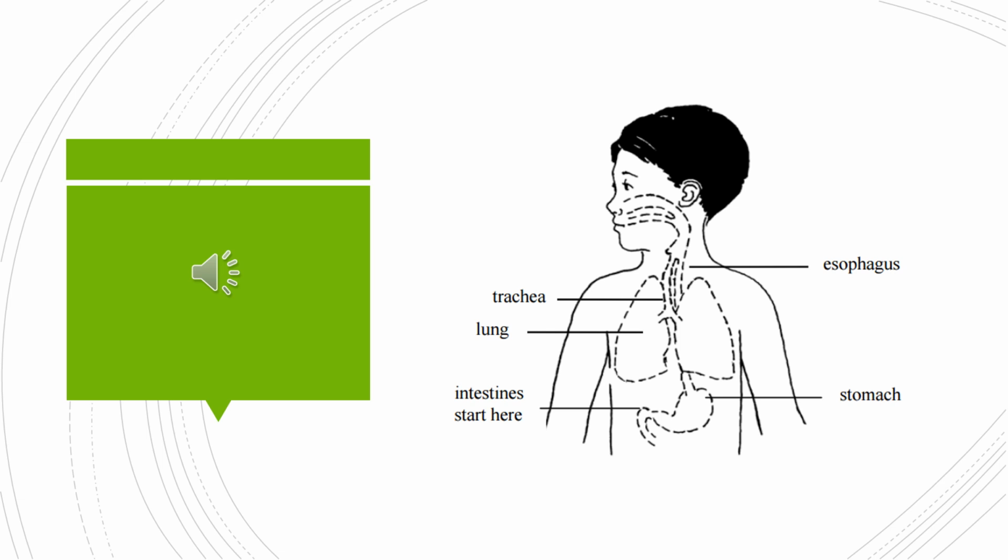The GJ tube is used widely in individuals with severely impaired gastric motility, high risk of aspiration, or an inability to feed into the stomach. It allows the stomach to be continually vented or drained while simultaneously feeding into the small intestine. GJ tubes are typically placed by an interventional radiologist in the hospital setting.